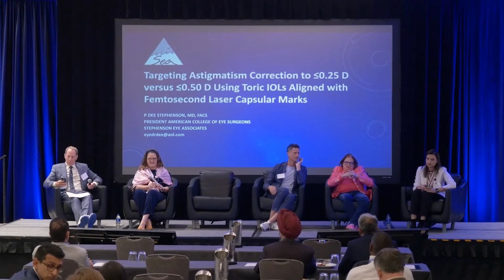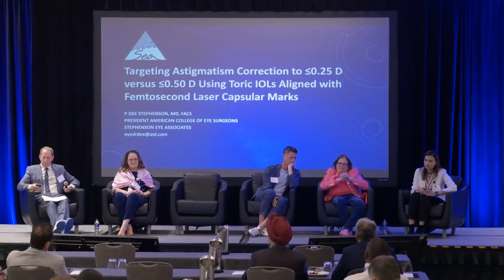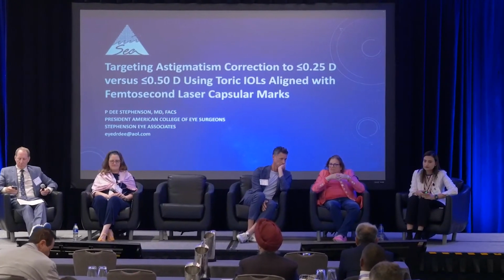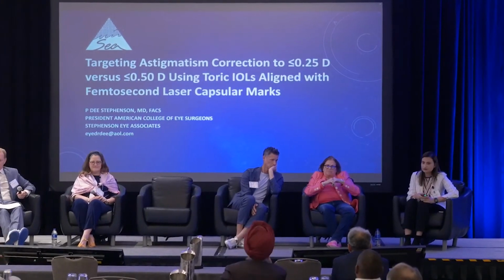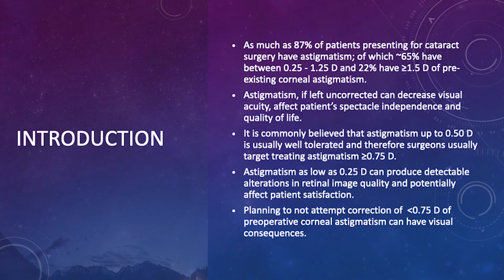I wanted to target astigmatism correction to equal to or less than 1/4 versus 1/2 a diopter of residual astigmatism using toric IOLs aligned with femto laser capsular marks with LENSAR. So Denise already said this, 87% of patients present for cataract surgery have some kind of astigmatism, and 65% between 1/4 and 1 1/4, and 22% are greater than 1 1/2.